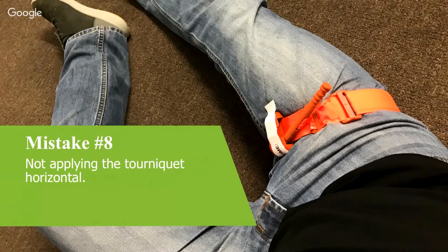The problem with this, and I've seen it fail on operations, unfortunately resulting in a fatality, is where a tourniquet was applied on an oblique angle. It was tightened, and the assessment was that it had occluded the artery. That patient, it was at night, in a high threat combat environment, and I'm certainly not making any judgment.